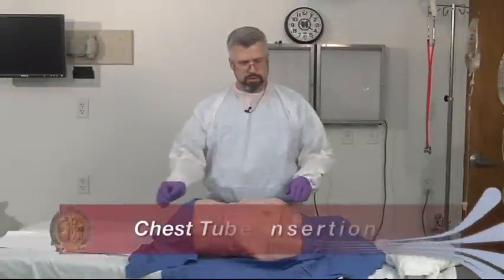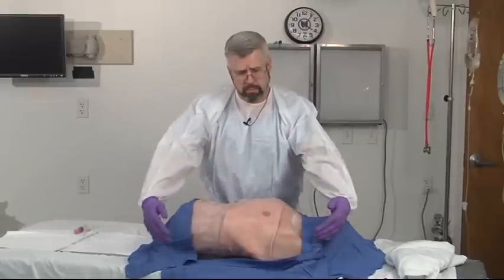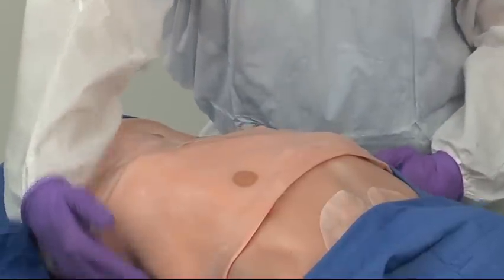The next procedure we're going to talk about is the chest tube. It's a given that when you do these procedures on the chest that we're going to prep widely. We're going to prep from the base of the neck all the way down to the pubic bone and then from side to side on the chest.